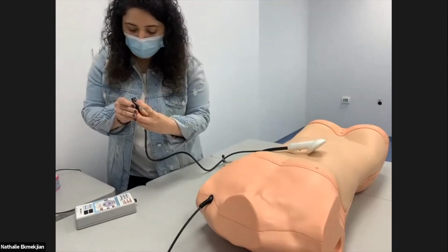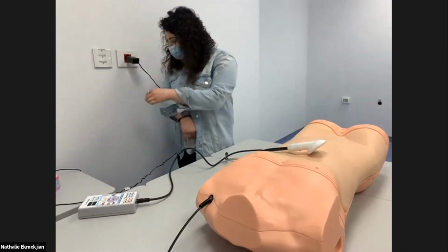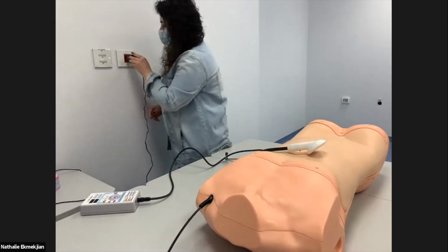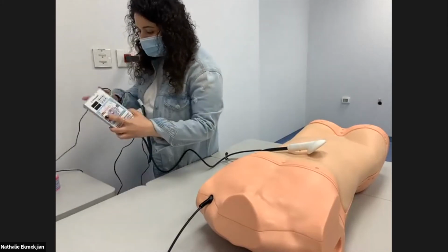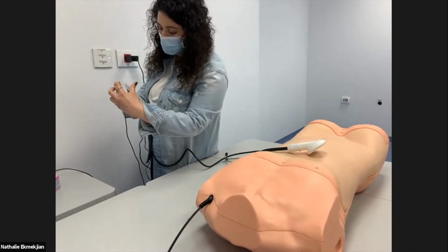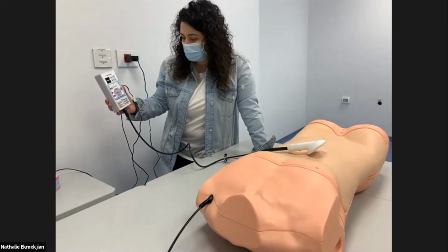We have the arrow up, we put it here, along with the power. Okay, and the speaker. We turn it on and should be ready to use.